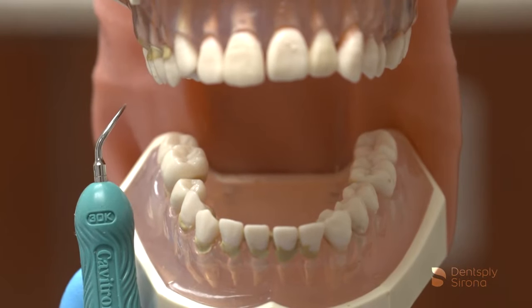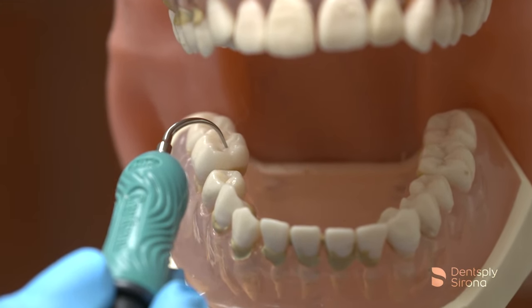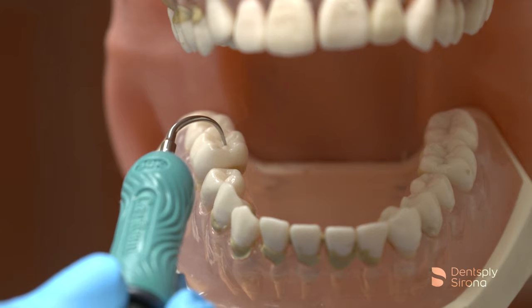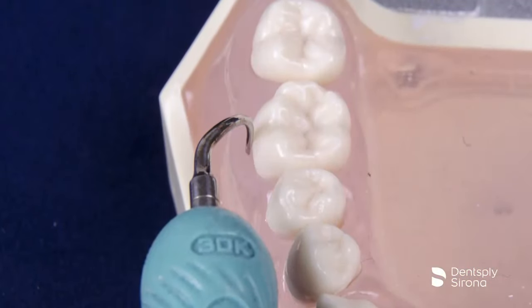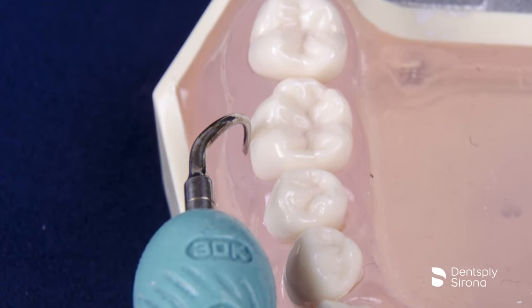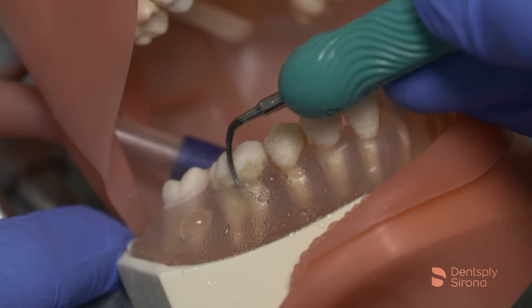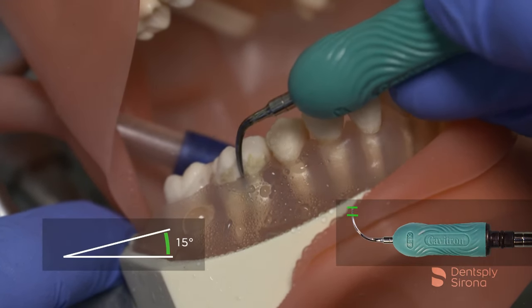It is also helpful to place the insert on the occlusal of the intended tooth to see the curvature and ensure you selected the correct insert. After this is established, maintain a vertical approach and notice that the back of the insert is adapted to the surface you are entering. Utilization of all surfaces is indicated for proper adaptation in periodontal pockets interproximally.